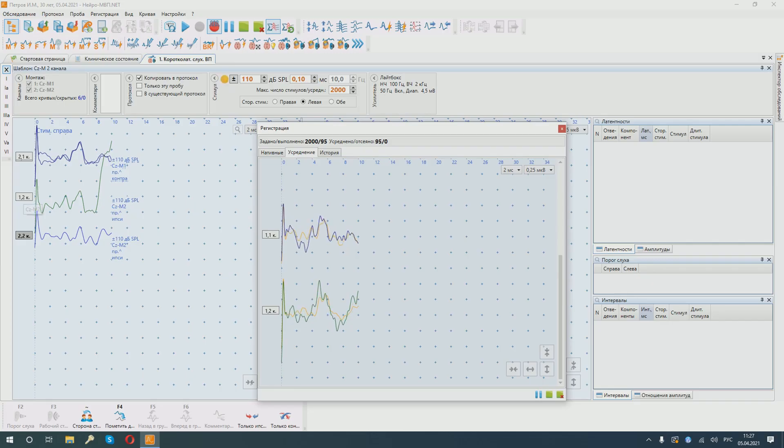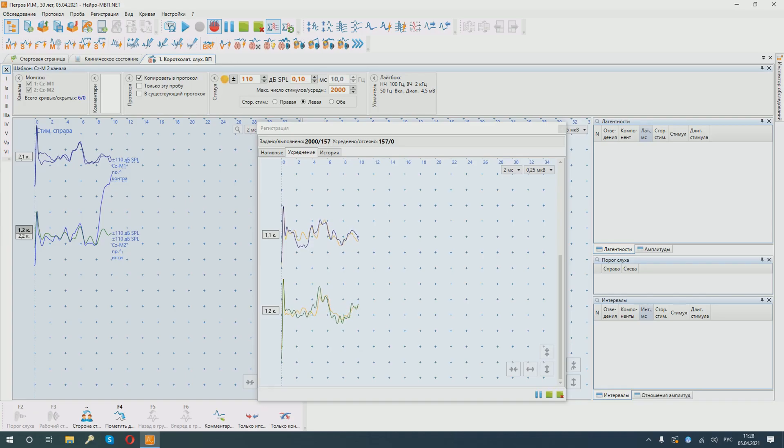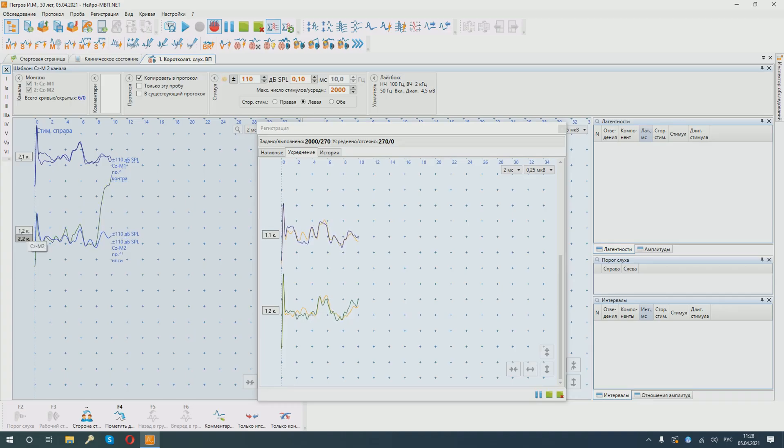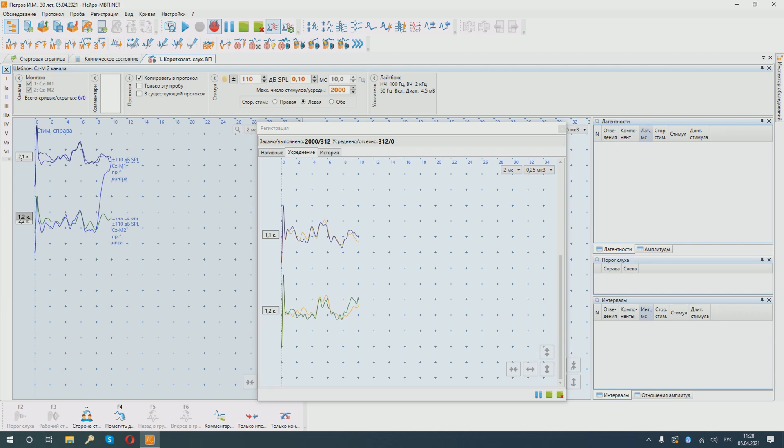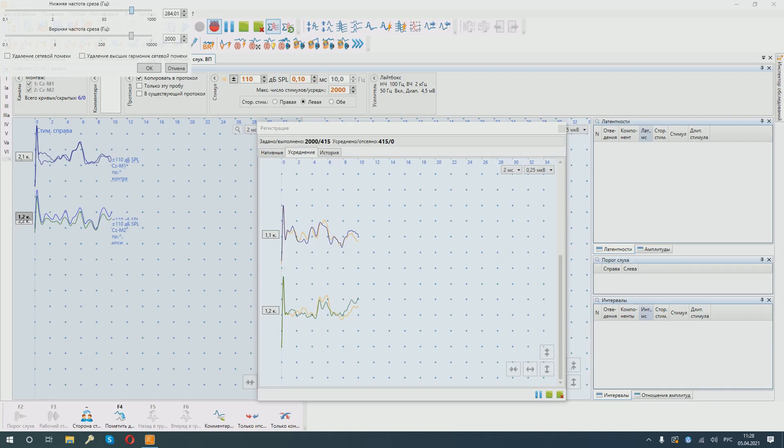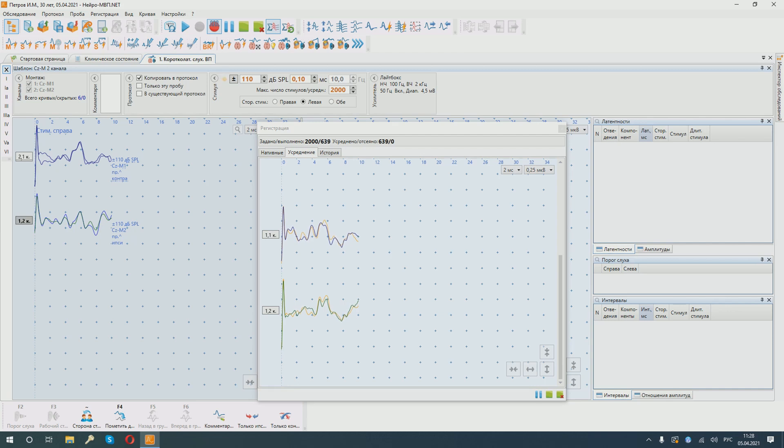In this case, we see good reproducibility of the third and fifth peaks on the right side. There is some horizontal distortion on the first peak, so we can try to perform curve filtering. We observe the peaks carefully, so that we don't lose important information. We see that the reproducibility is good. We got rid of such a strong influence of the reflex of the occipital muscle, and we can further position the necessary markers on the ipsy side on one of the curves.